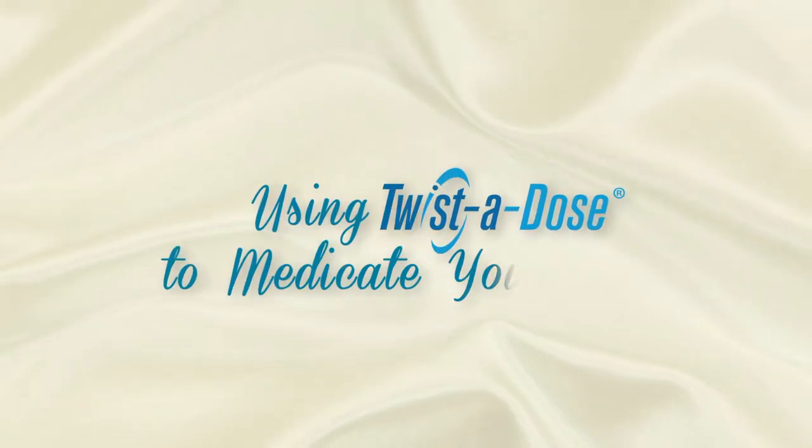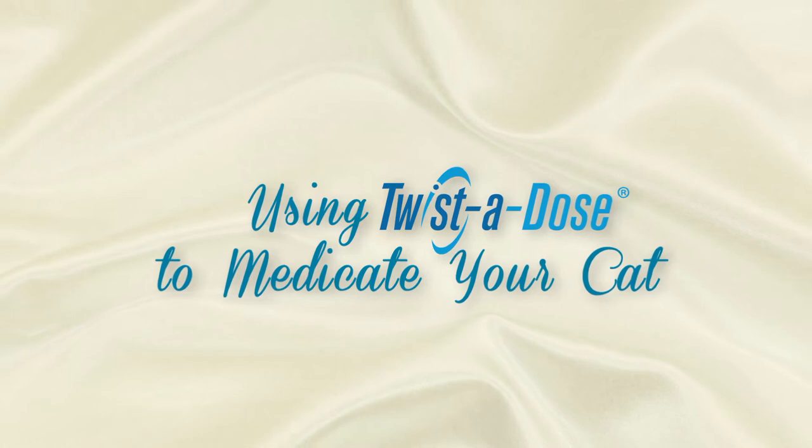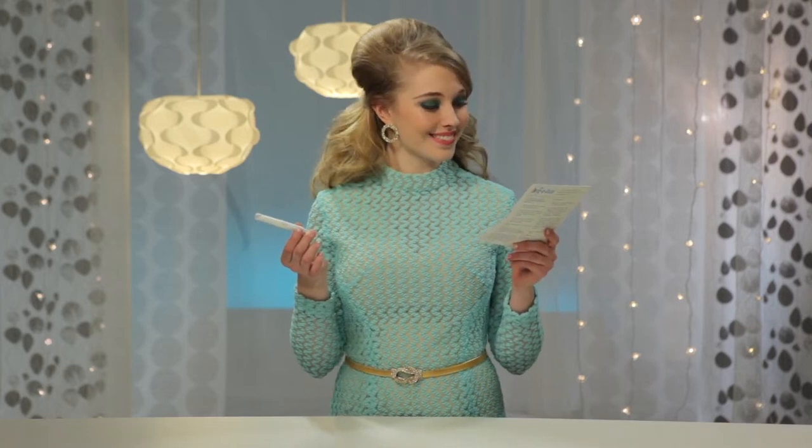Using Twist-a-Dose to medicate your cat. Your veterinarian knows that it can be quite an ordeal to give a pill or capsule to a cat, especially when she isn't feeling well. So your veterinarian has prescribed your cat's medicine in Wedgwood Pharmacy's easy-to-use Twist-a-Dose gel applicator. We care the way you care about your pets. In this brief video, we'll demonstrate how easy it is to apply your cat's medicine to the inside of her ear.